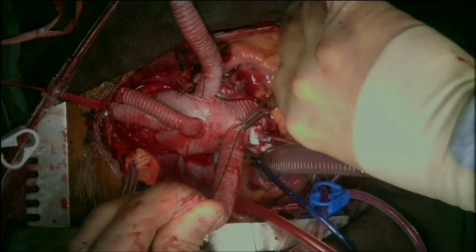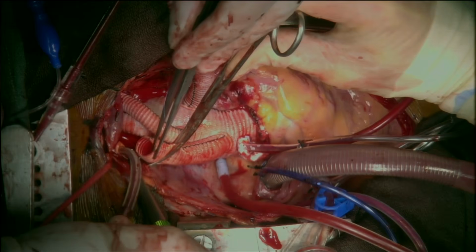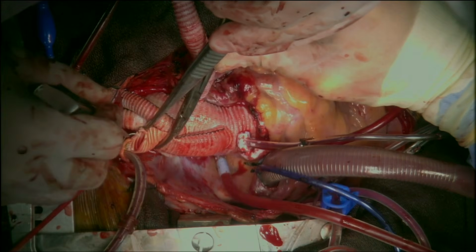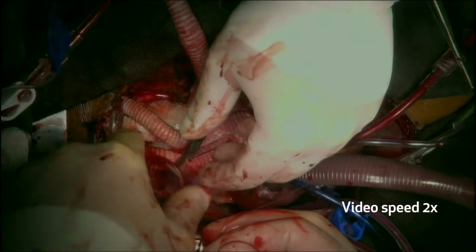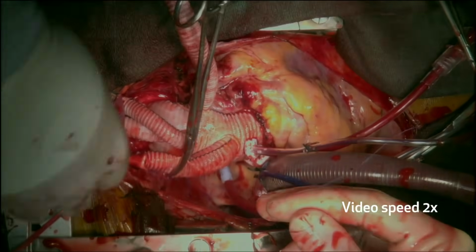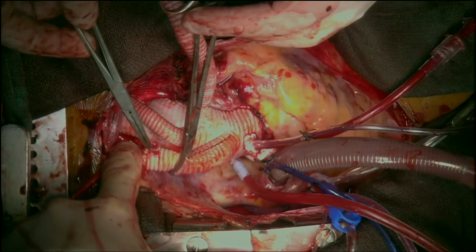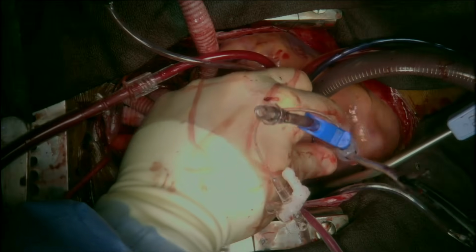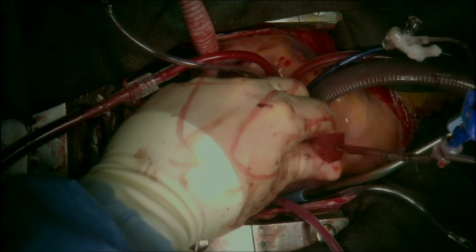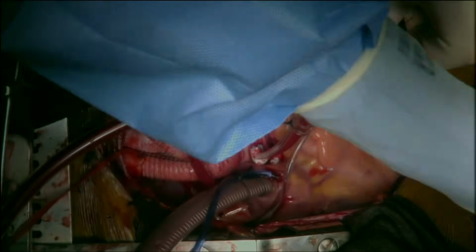At this point, the first 12 millimeter sidearm of the graft was trimmed and anastomosed to the innominate artery using a running 5-0 Prolene suture. The last head vessel anastomosis was de-aired as the clamps were released. The retrograde cardioplegia catheter was removed. Bipolar pacing wires were placed on the inferior aspect of the heart. The LV vent was removed, and the root vent was removed.